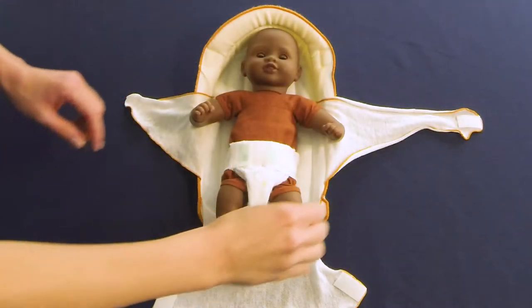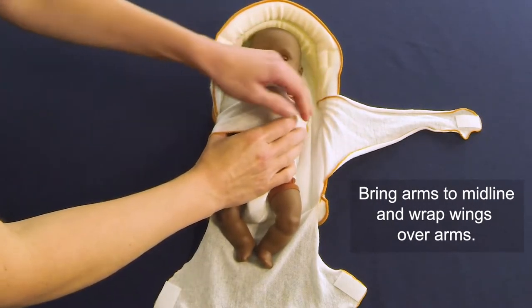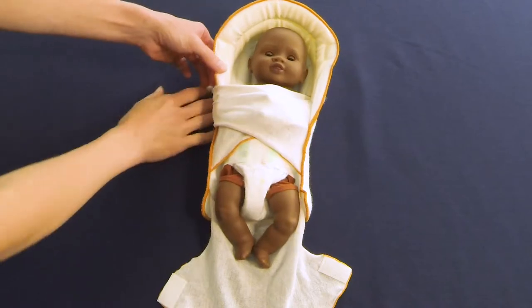Place the baby in the Rulite with the head touching the head roll. Bring the arms flexed to midline and pull the short wing over the infant, ensuring the shoulders are rounded forward. Wrap the longer wing over the shorter wing and attach with Velcro to the back of the positioner.